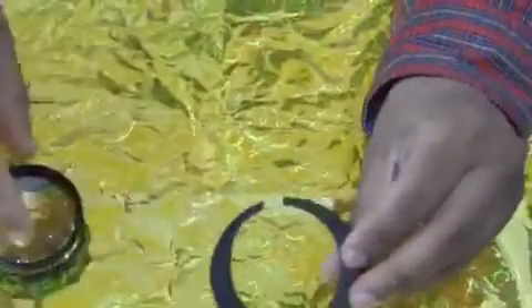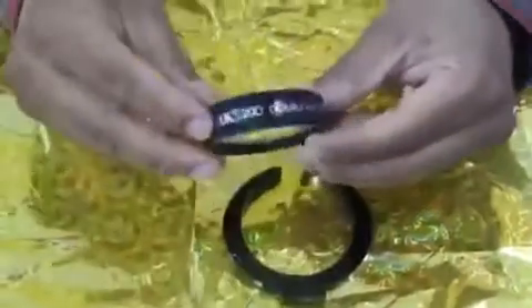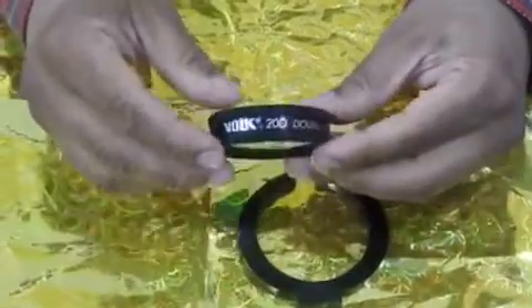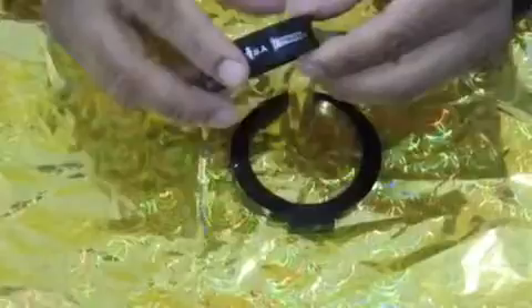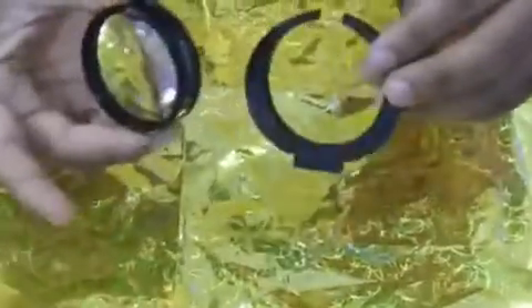This is the lens holder for our 20 diopter lens. That's the 20 diopter lens which we regularly use for viewing the fundus. A 28 diopter lens can also be used.